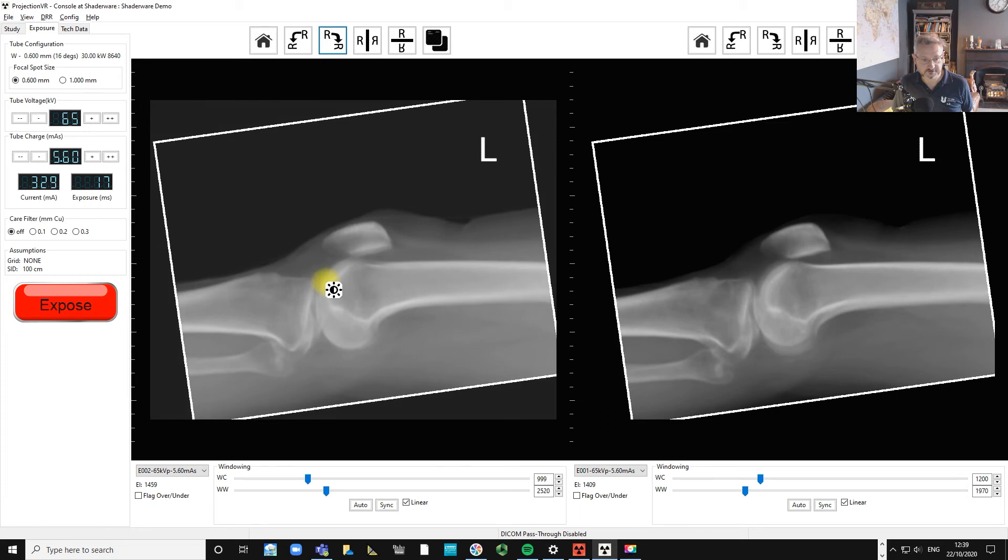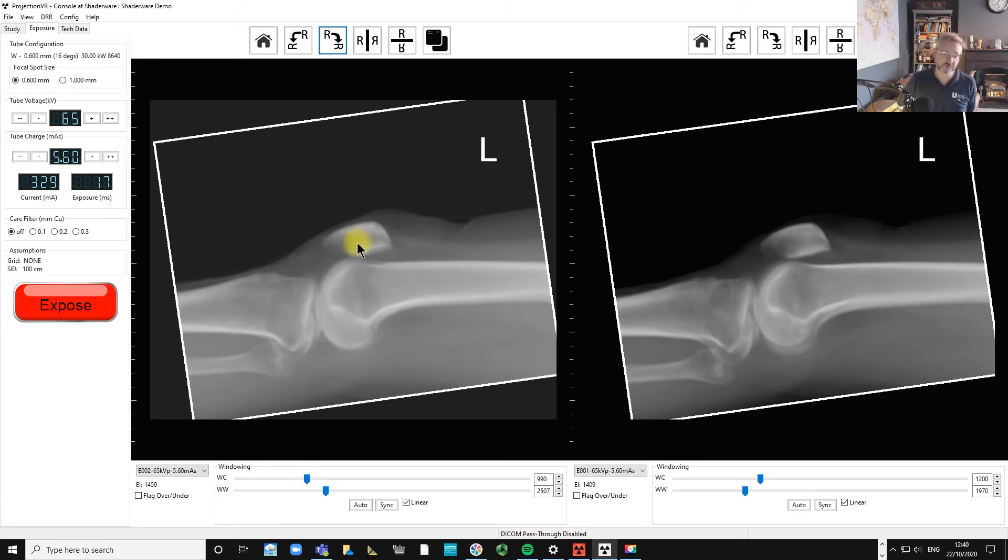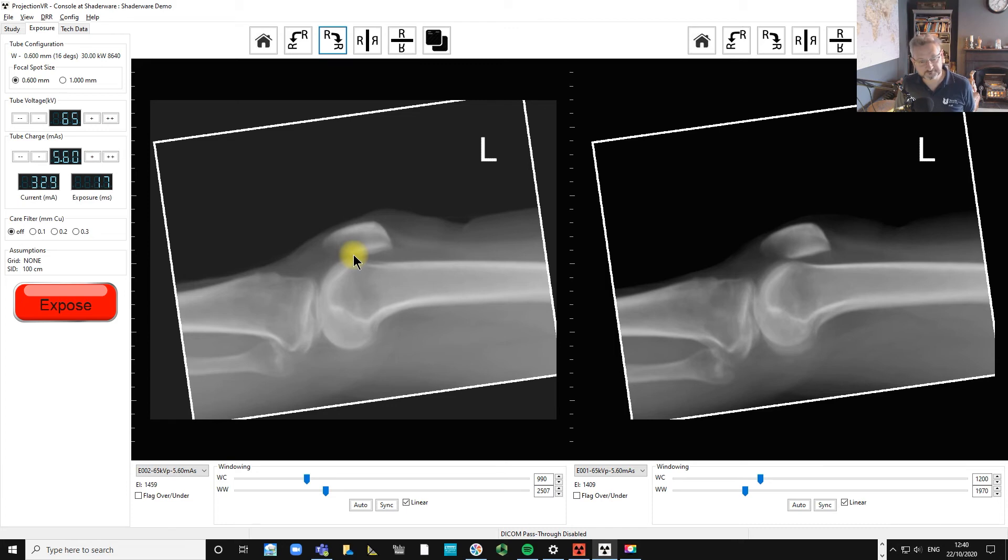So now we're in a really nice position with a very nice lateral, with both our medial and lateral condyles superimposed of the femur. So that's quite nice. In terms of centering point, I have centered slightly high and slightly proximal.